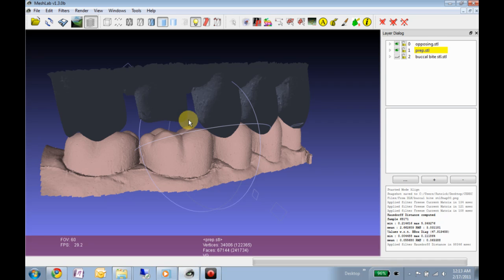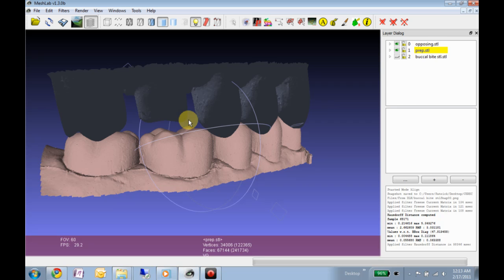So this is my attempt at doing that virtually, and unfortunately this particular time that I prepped this tooth and took these scans, my dentiform was not in good occlusion, so this won't be as exciting as if it were in textbook occlusion.